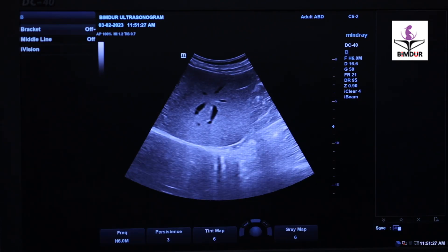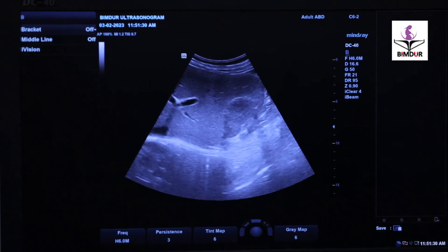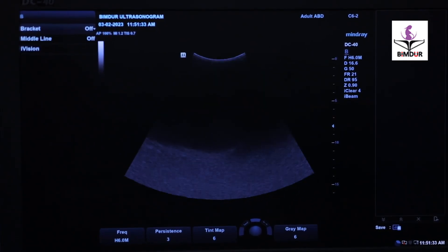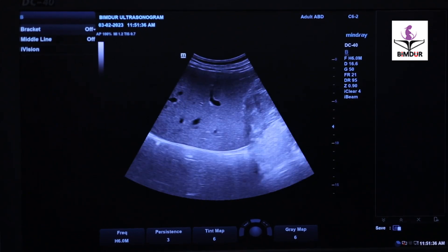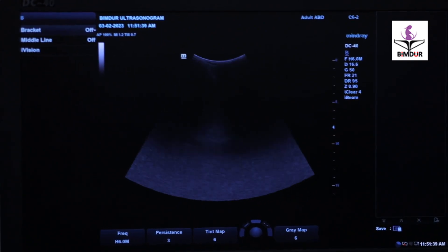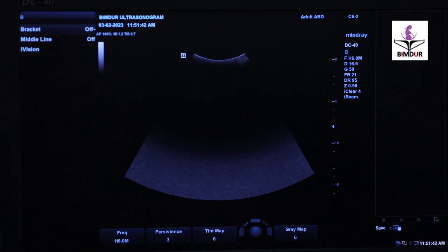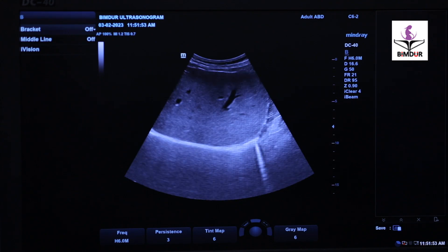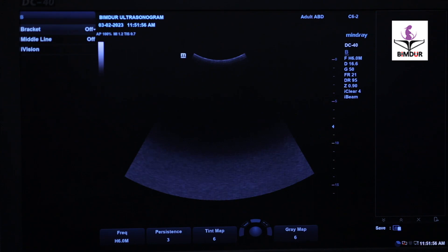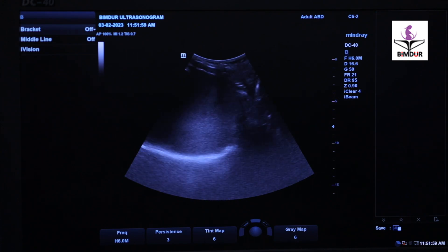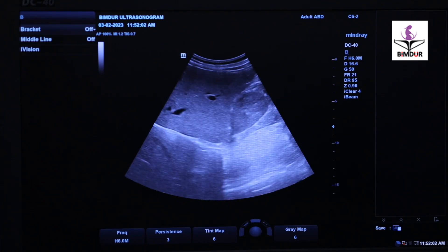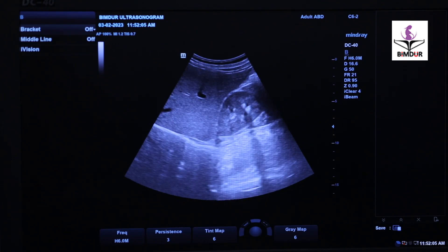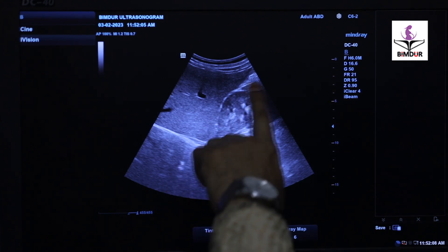Probe direction and organ relation: when we see the right kidney, we set the probe in the mid axillary line, sagittally and sagittal obliquely. We then see the skin and a sagittal image of the right kidney.